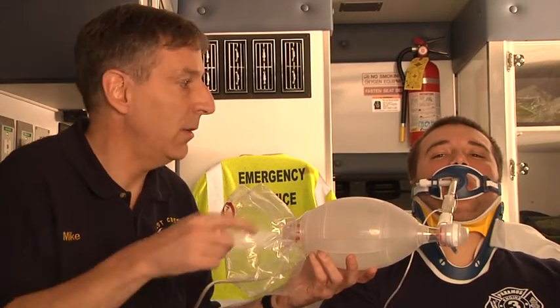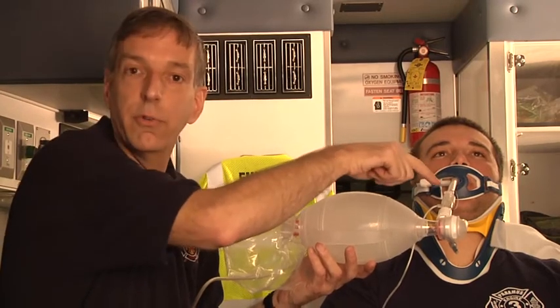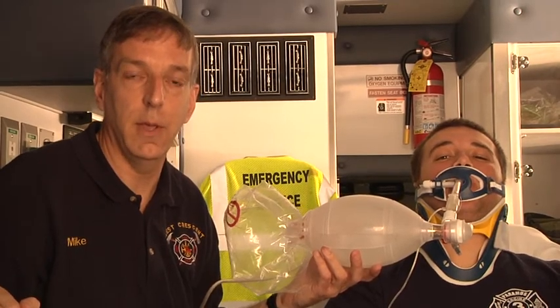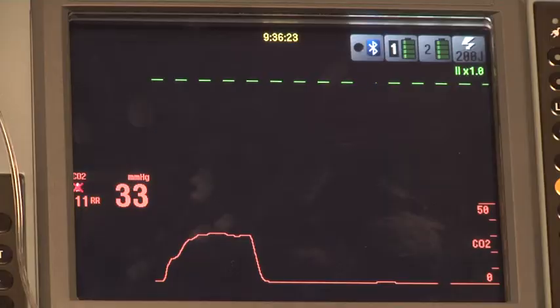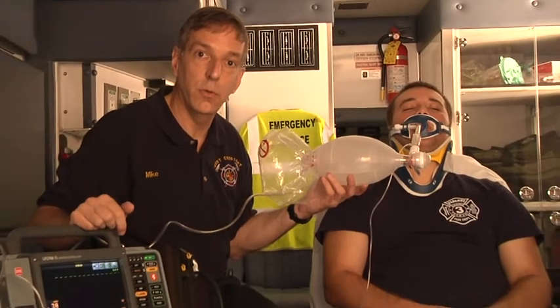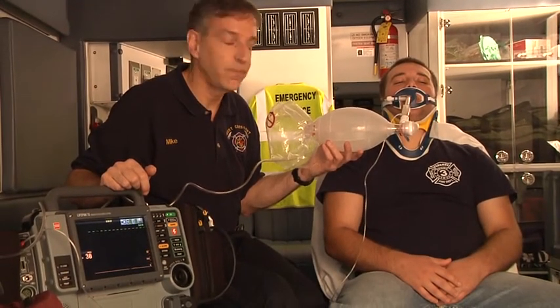You notice that this patient has a cervical collar on, and most EMS systems require paramedics to place a cervical collar on any patient with an artificial airway to prevent the possibility of the tube being dislodged. That's not enough, however. It's mandatory to have monitoring continuously of the waveform to make sure that not only is the patient breathing, but that the tube is properly placed.